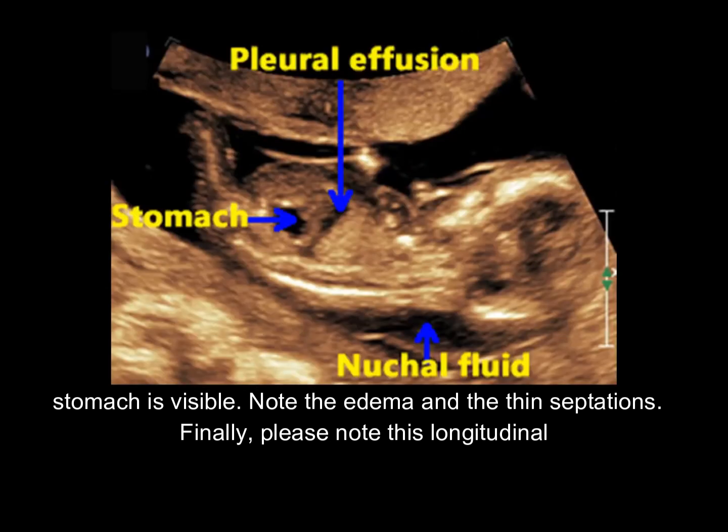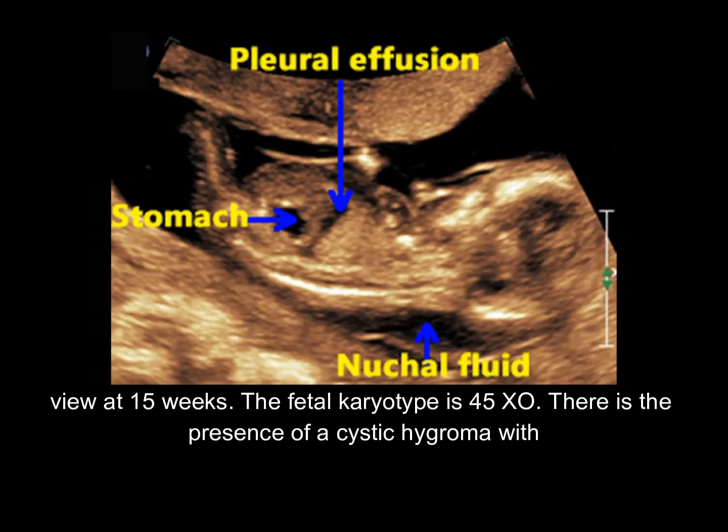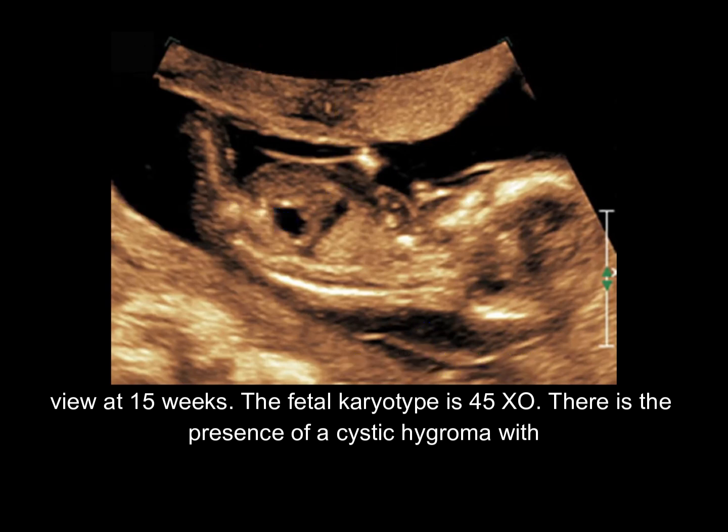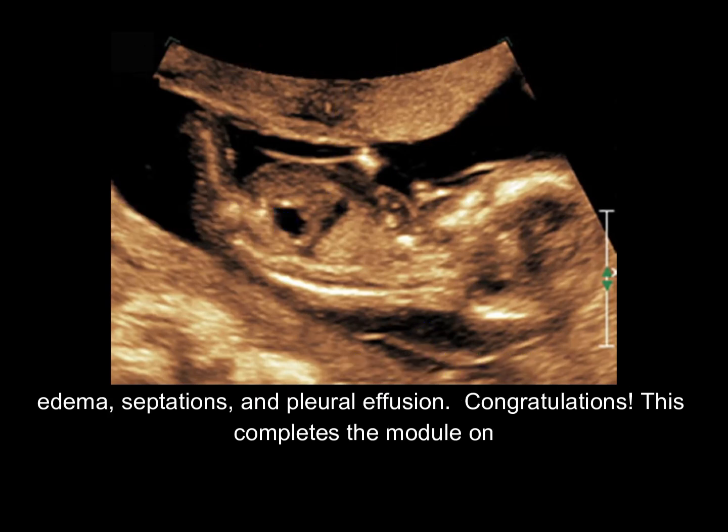Finally, note this longitudinal view at 15 weeks. The fetal karyotype is 45,XO. There is the presence of a cystic hygroma with edema, septations, and pleural effusion.